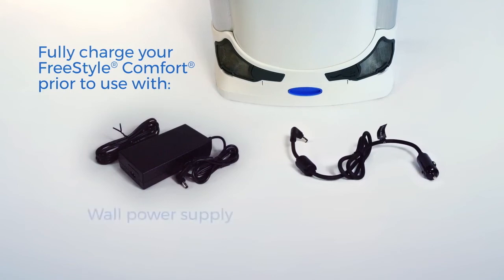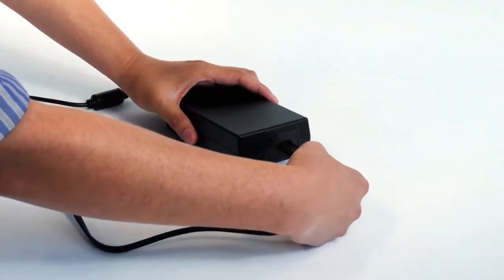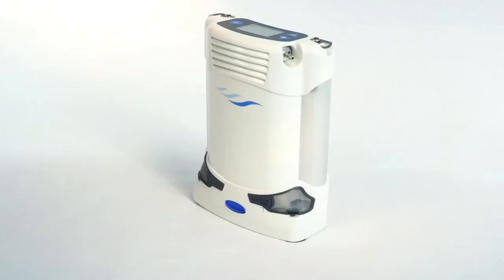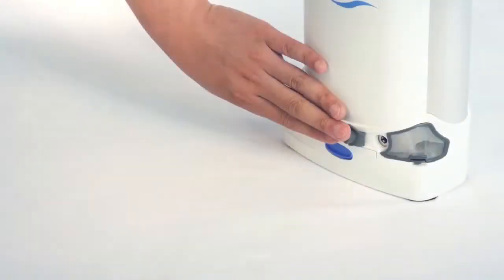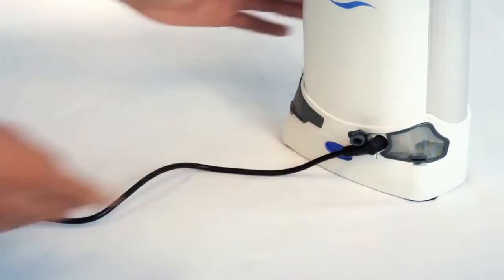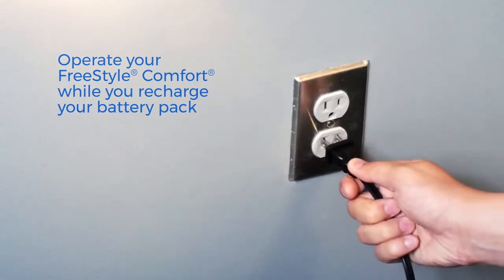You can charge your unit by AC wall power or DC motor vehicle power. To charge your device using wall outlet power, take the wall power supply and ensure that the input power cord is connected. To connect your AC power cord, first lift the receptacle tab on the front of the device to reveal the power port, then plug the power connector into the unit to allow the unit to charge. Battery charge times are indicated in the user manual, and it's important to note that you can operate the unit while plugged into the wall and still allow the battery to charge.